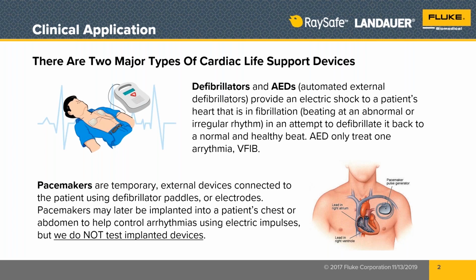So AEDs are there as a first responder tool. You don't have to know very much to be able to use them because of their design. We'll talk more about that as we get along.